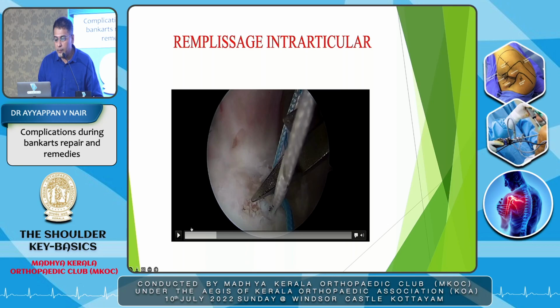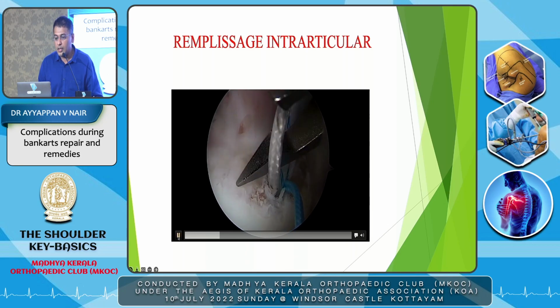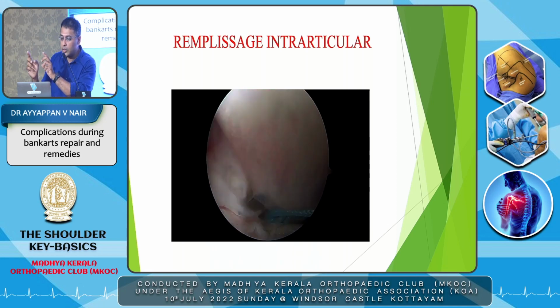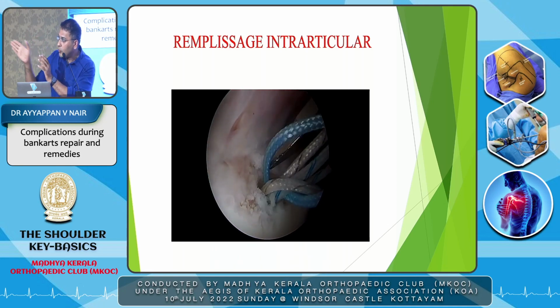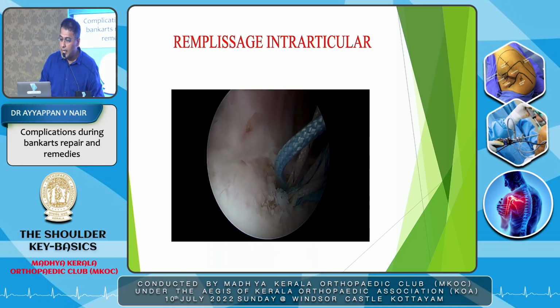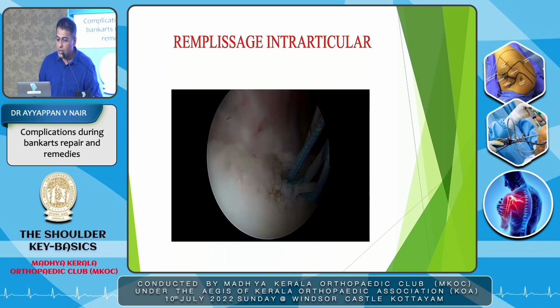This is a technique of intra-articular. So you can see that it's a proper visualization. This is a posterior port. Shift the camera to face this side, onto the side of the glenoid, on the head, and you can pull it one by one like this.